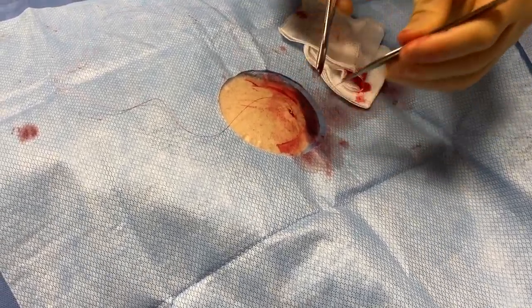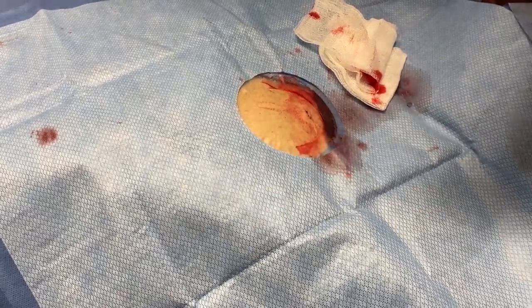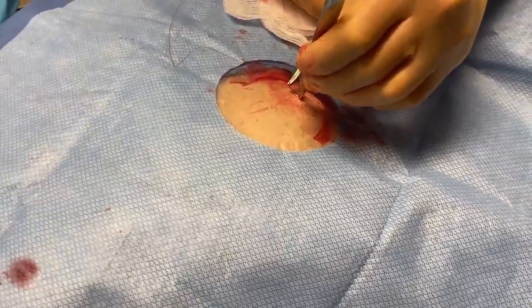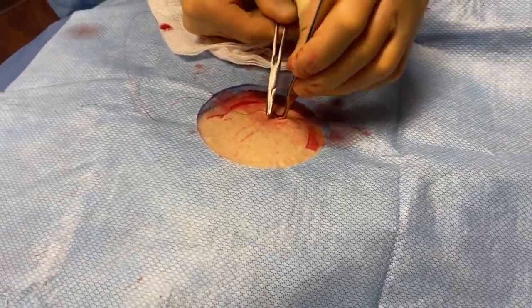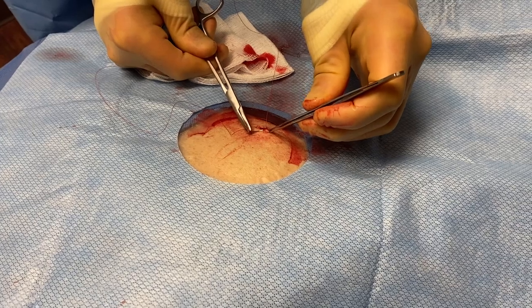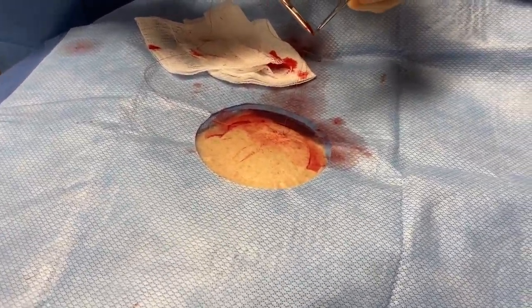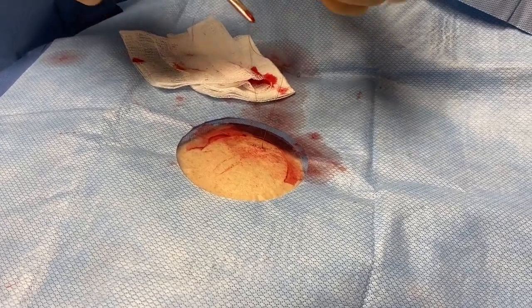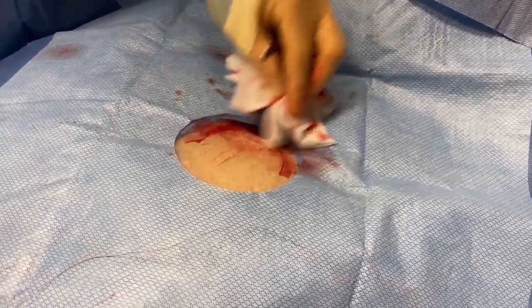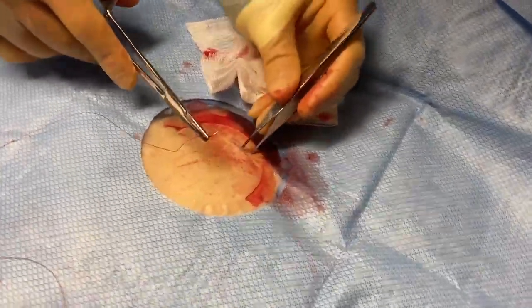The skin's just a little bit non-compliant with this gentleman. So we see that it's holding together very nicely.